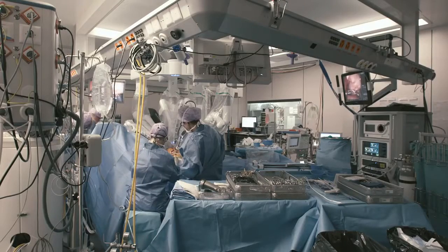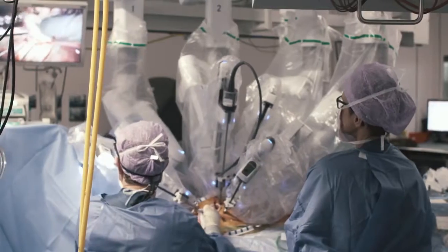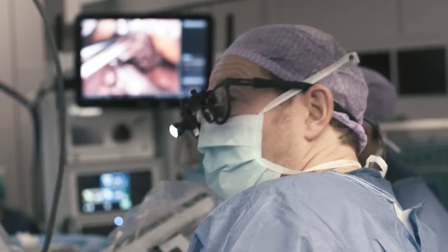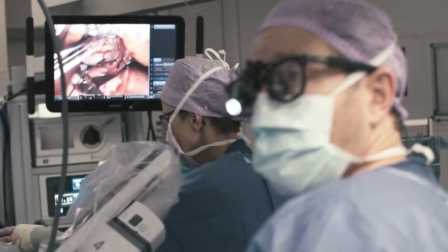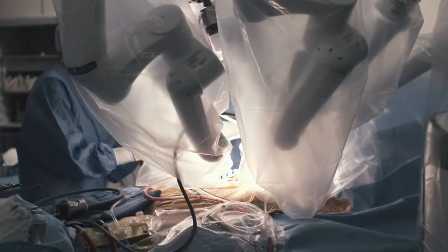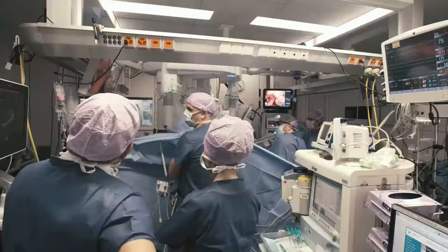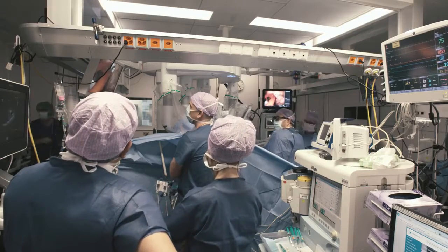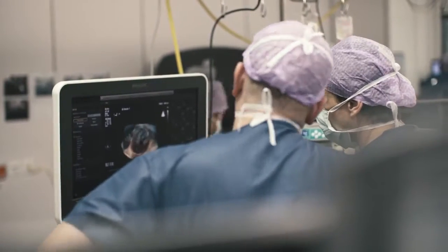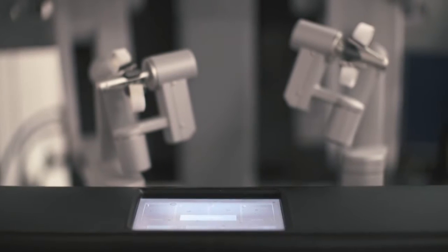The principles of mitral valve repair are to preserve the patient's own leaflet tissue, which leads to excellent long-term outcomes. The DaVinci robot is an enabling technology which assists surgeons in achieving this goal. Once the procedure is finished and the mitral valve is reconstructed, cardiopulmonary bypass is weaned and the result is assessed on echocardiography. When this is considered perfect, the operation is finished, cardiopulmonary bypass can be removed, the robot can be removed, and the access sites are closed. The patient can now go back to the intensive care unit.